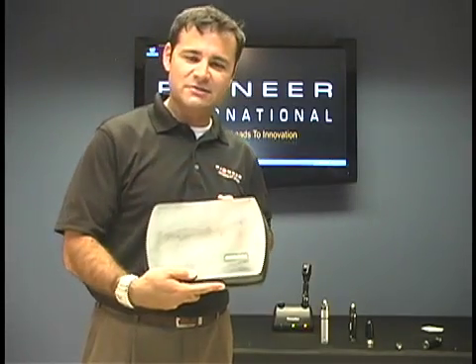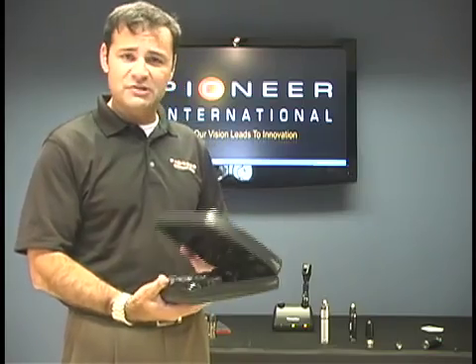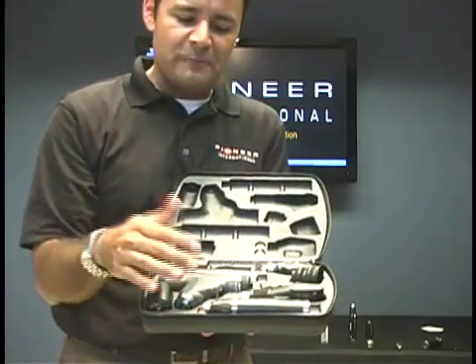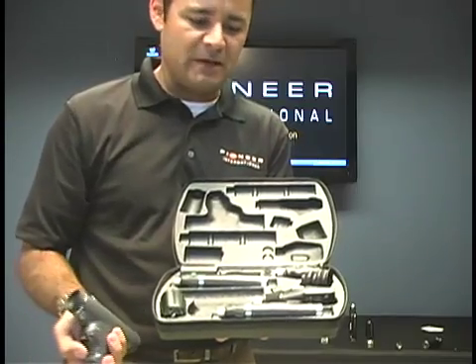You'll see a bunch of the different diagnostic sets out there. This happens to be one of the most popular ones. You'll just unzip, fold it open, and you've got your different heads and your handles. Some schools, the most popular one sold is this one. Some schools, it might be without the Panoptic. It just depends.